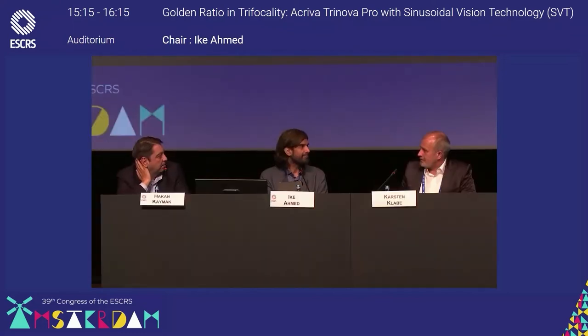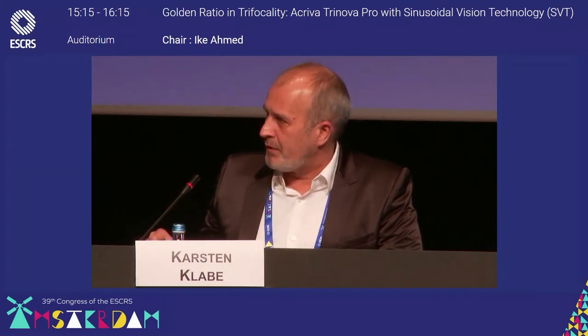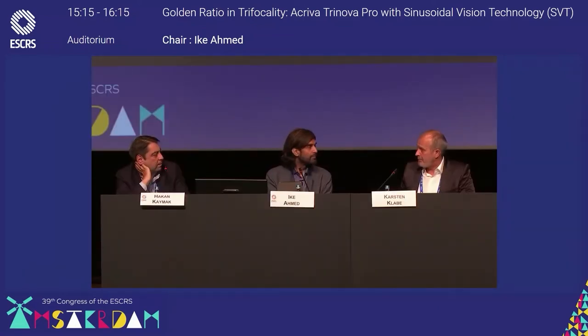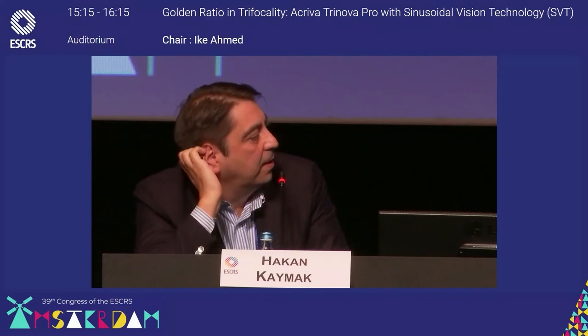Slight hyperopia, a quarter of a diopter. The patient is really happy. If you implant a multifocal or trifocal and the patient is still slightly myopic, it doesn't work. You don't have a happy patient, because the expectation is a brilliant far vision, which I can understand. The aim is emmetropia, but if you want to be on the safe side, you go a little bit in the hyperopic direction. But emmetropia, that's the best.